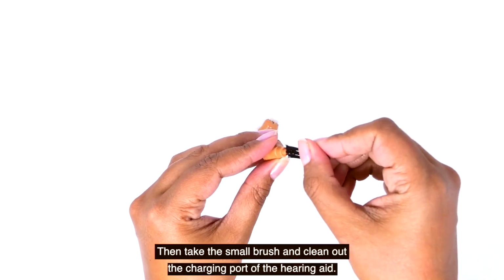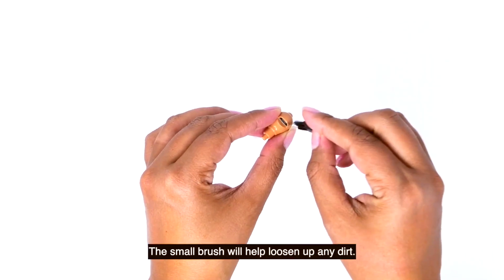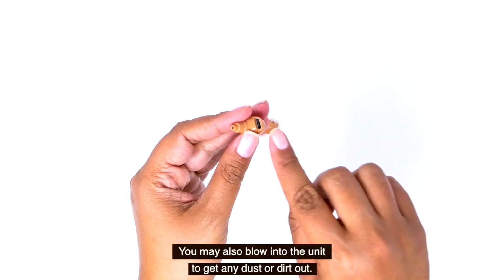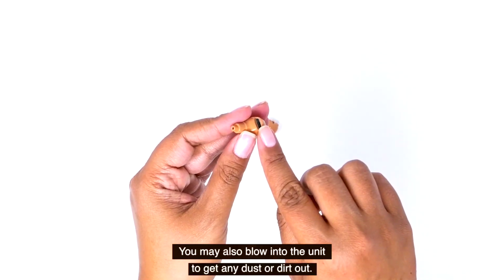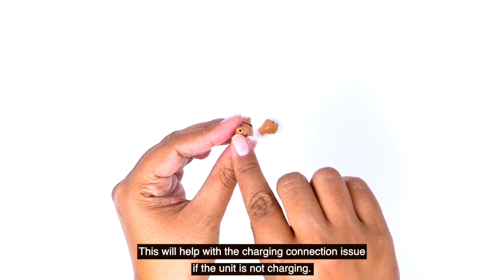Then, take the small brush and clean out the charging port of the hearing aid. The small brush will help loosen up any dirt. You may also blow into the unit to get any dust or dirt out. This will help with the charging connection issue if the unit is not charging.